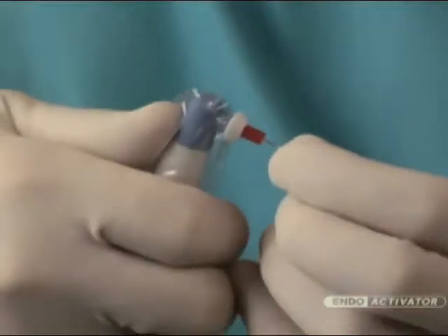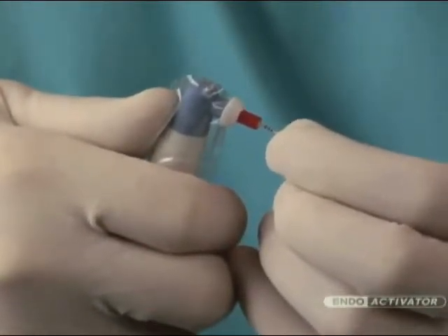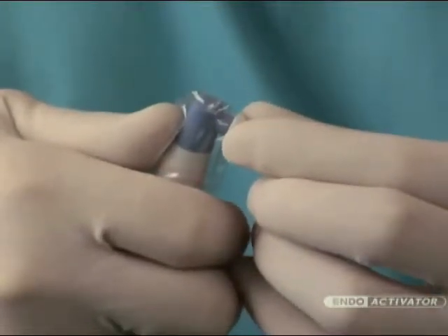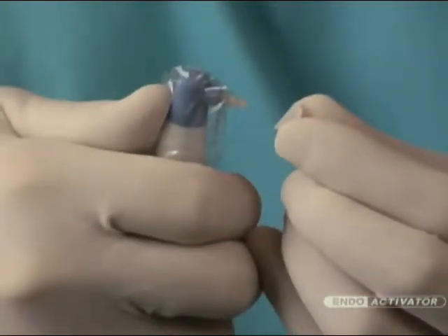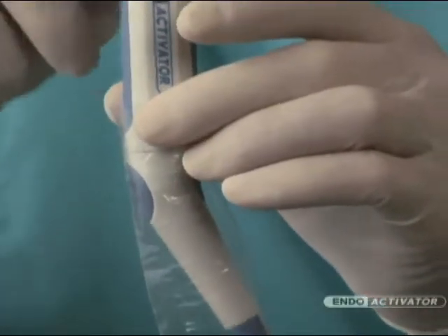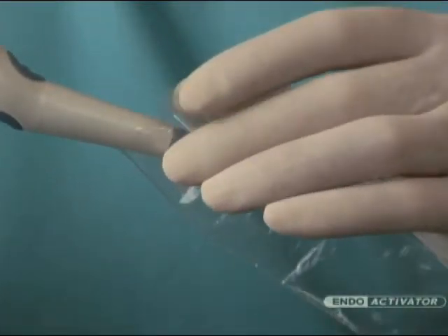When the clinical procedure has been completed, firmly support the contra-angled neck of the handpiece and remove the attached activator tip by grasping the large circular clean guard portion with fingers and snap off. Next, remove the protective barrier sleeve. Discard the activator tip and barrier sleeve as they are for single patient use only.